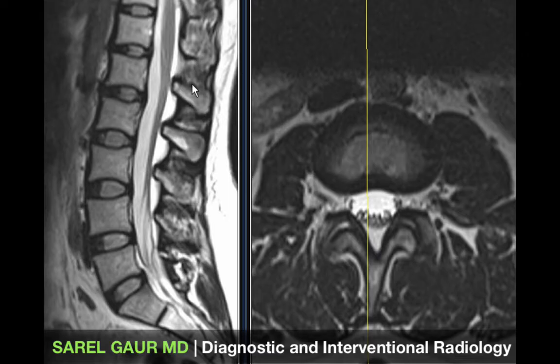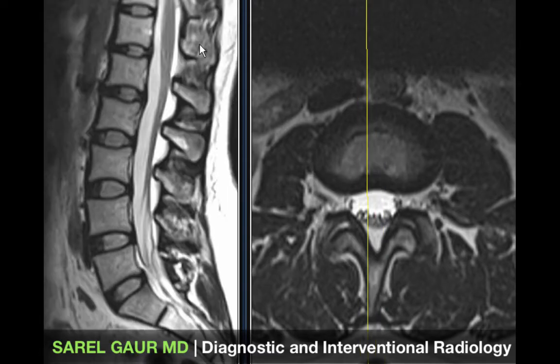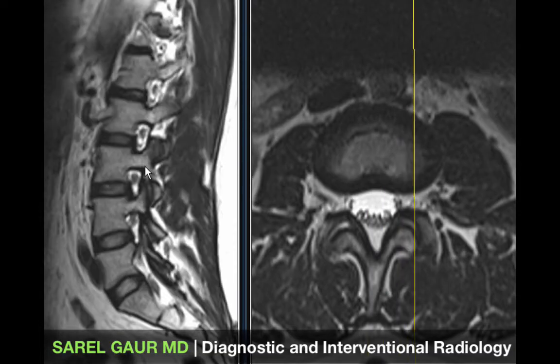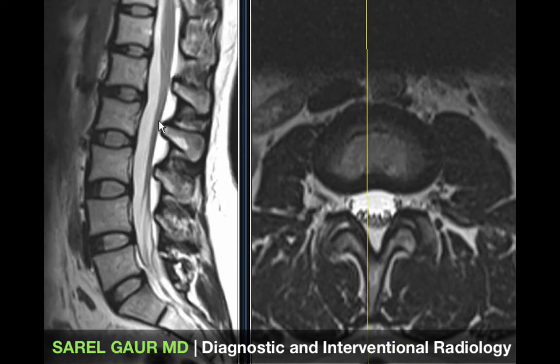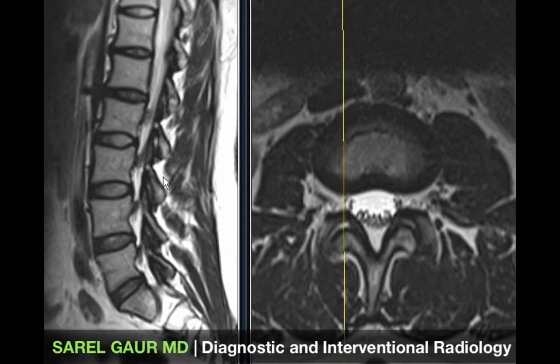Posterior to that I have the spinous processes, which are basically part of the posterior elements seen on either side of the spine. These enclose and protect the spinal canal.